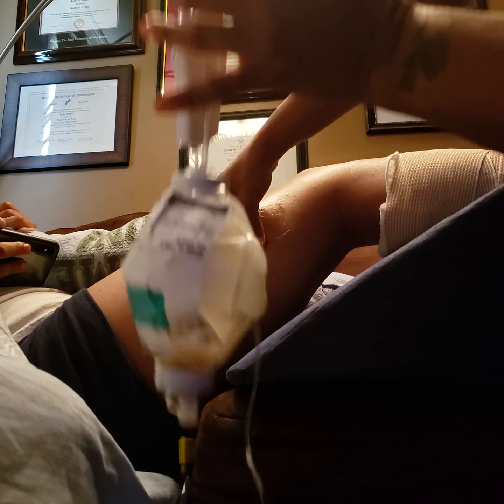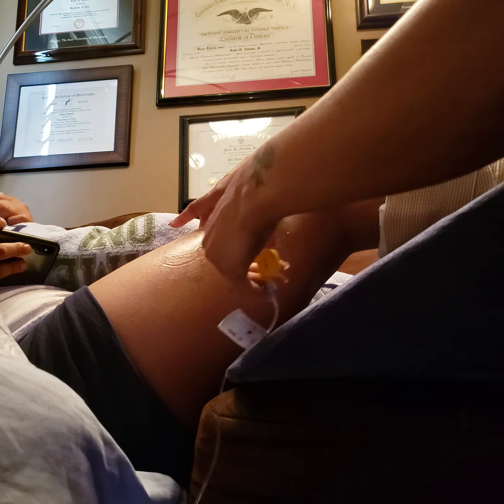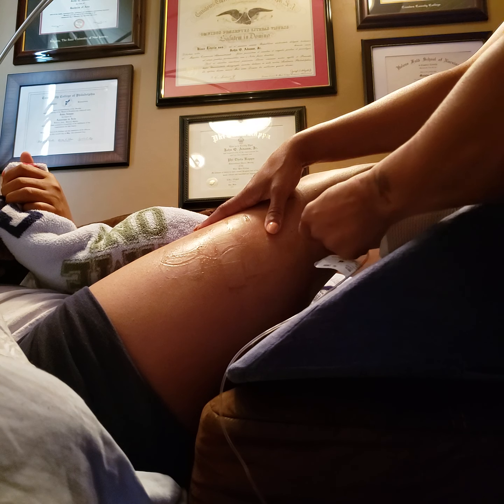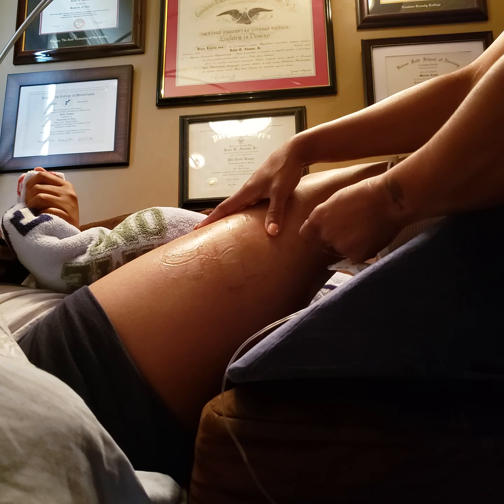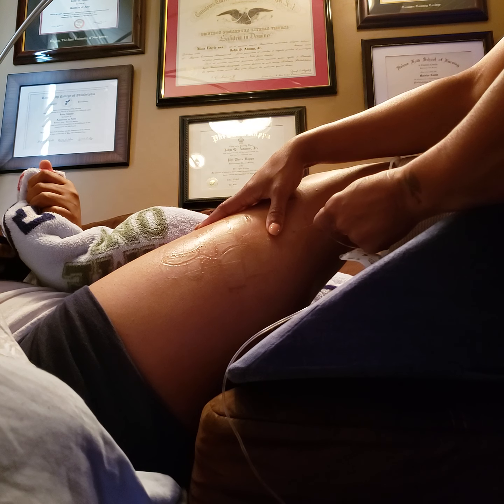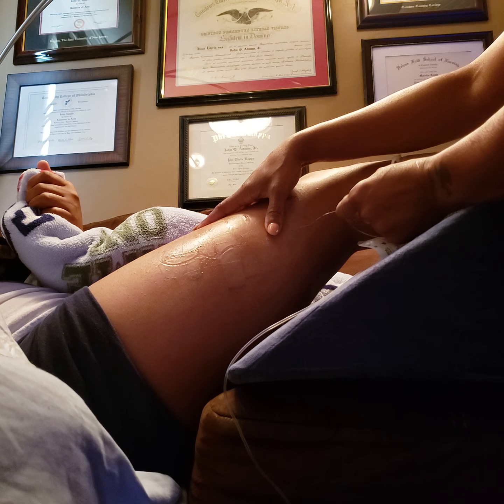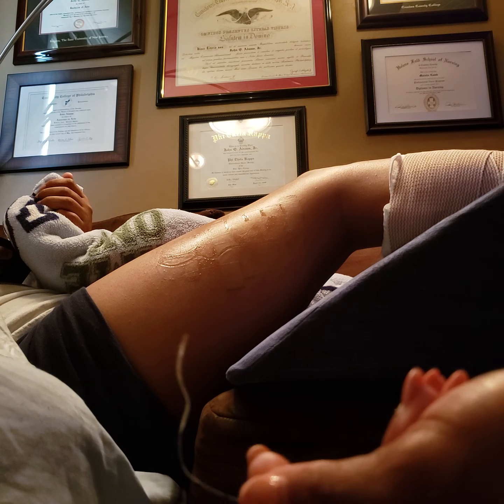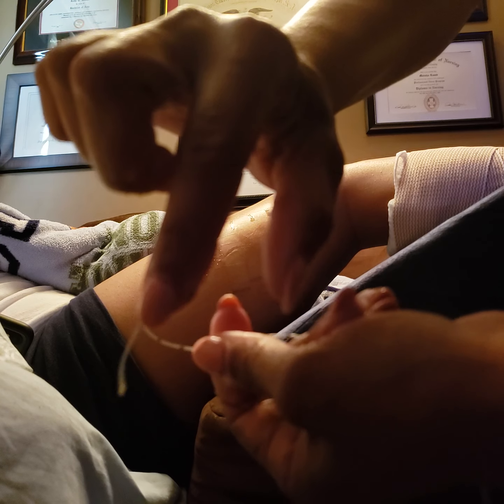You can see there's a lot of meds left in here, but they only wanted him to have it for about two days. Oh, that was weird. They said it's about three inches long — it kind of feels like you're pulling out a vein. Okay, so it wasn't that much. Here's the little gold tip — there's still some meds coming out but the gold tip is there.